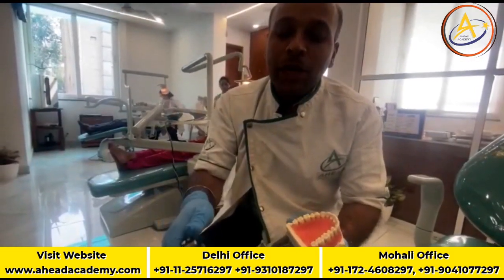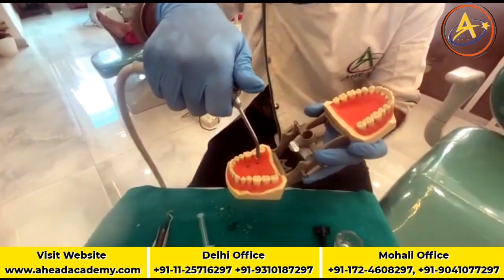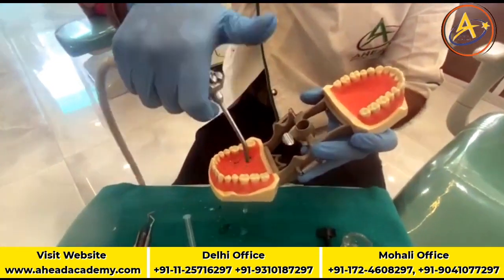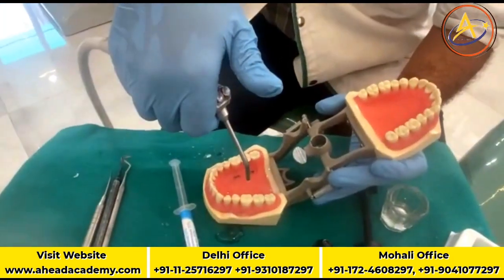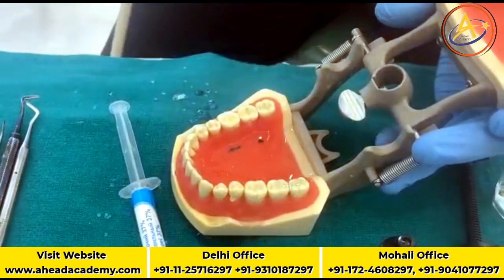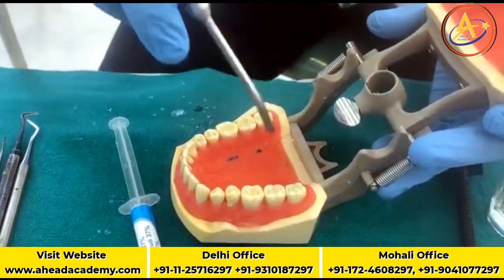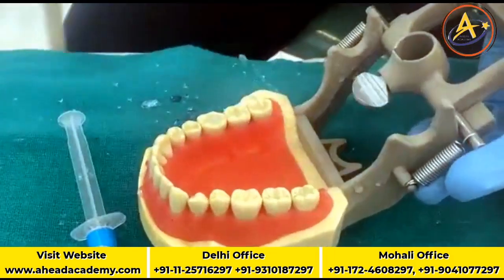So you have to keep on washing. For how much time? The water should go constantly for 20 seconds. That is the guideline. Keep on applying the water for 20 seconds. Then after 20 seconds, again dry the surface and re-isolate the tooth.